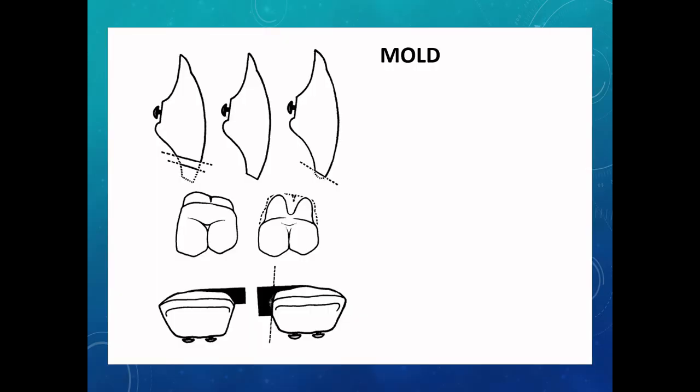Coming to the first consideration, that is the mold. So selection of an acceptable personality mold involves its subsequent treatment for attrition, abrasion, erosion, depth grinding, shaping, polishing, etc. So here you can see in the first picture, we have reproduced attrition by grinding of the incisal edges, and here we have reproduced erosion, and the third one, the depth perception.